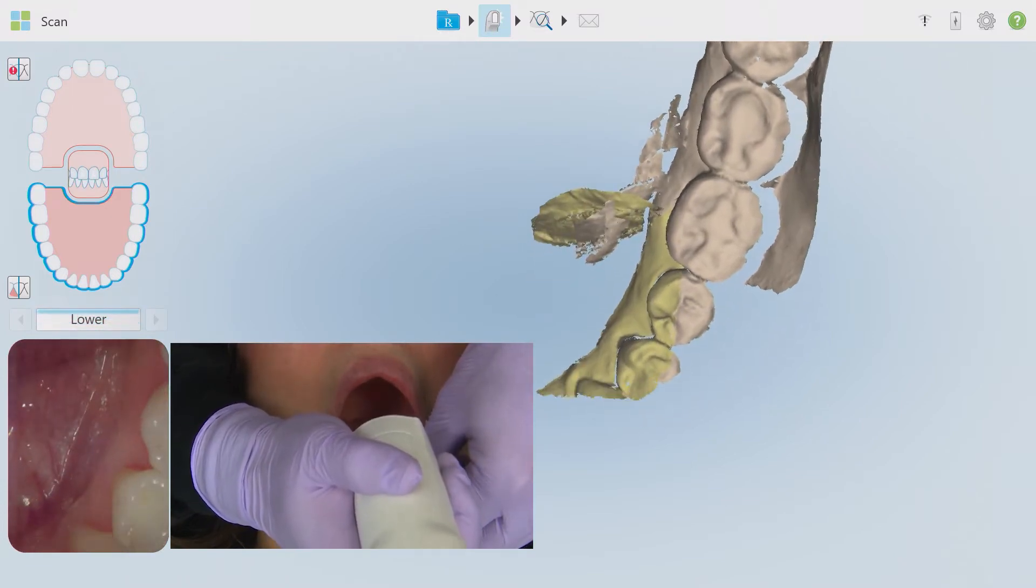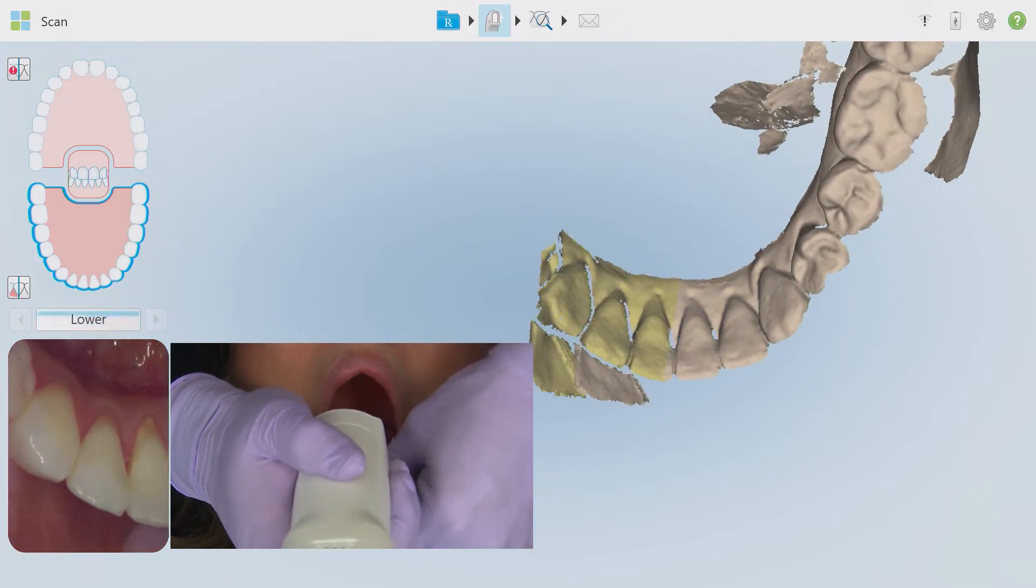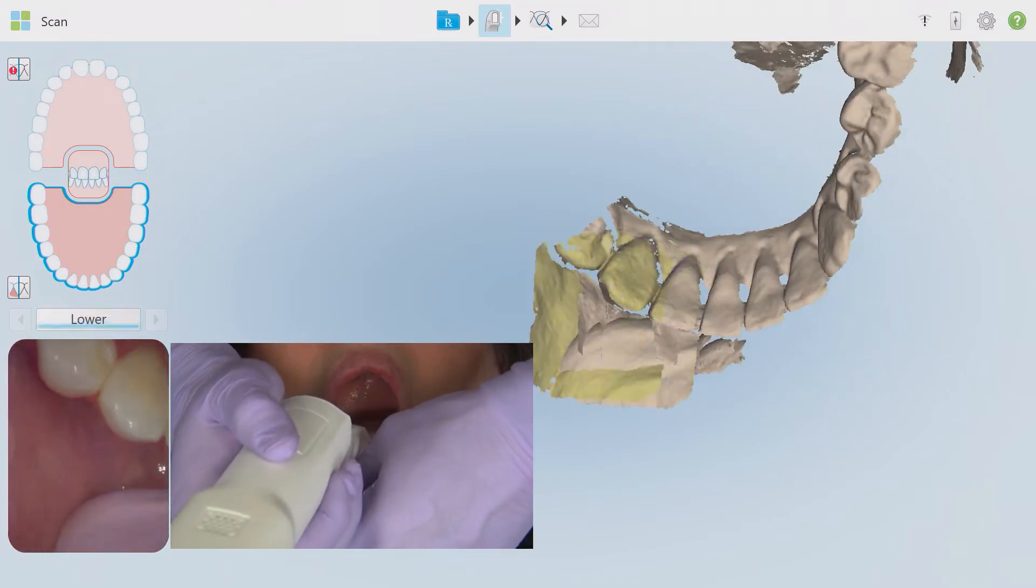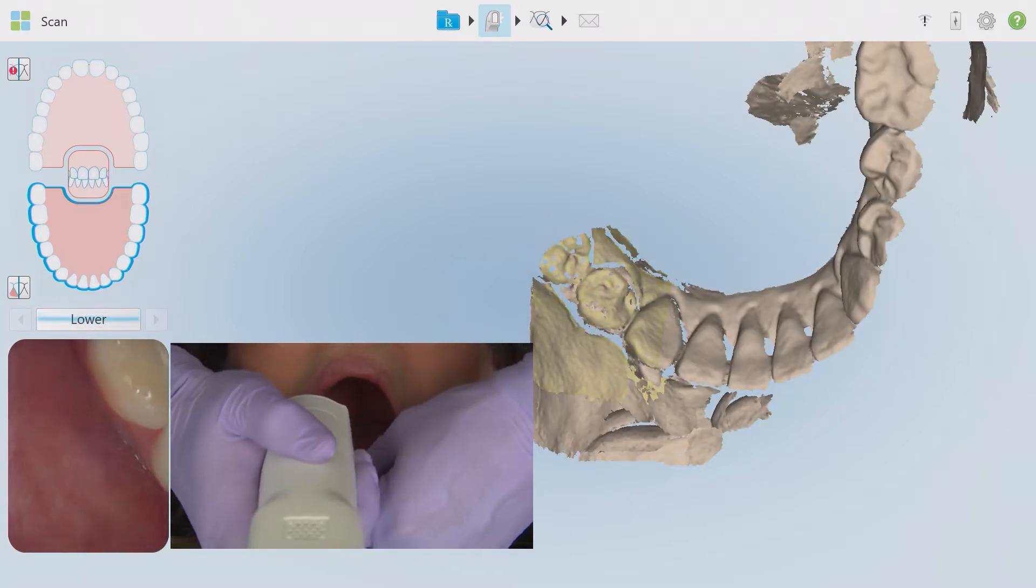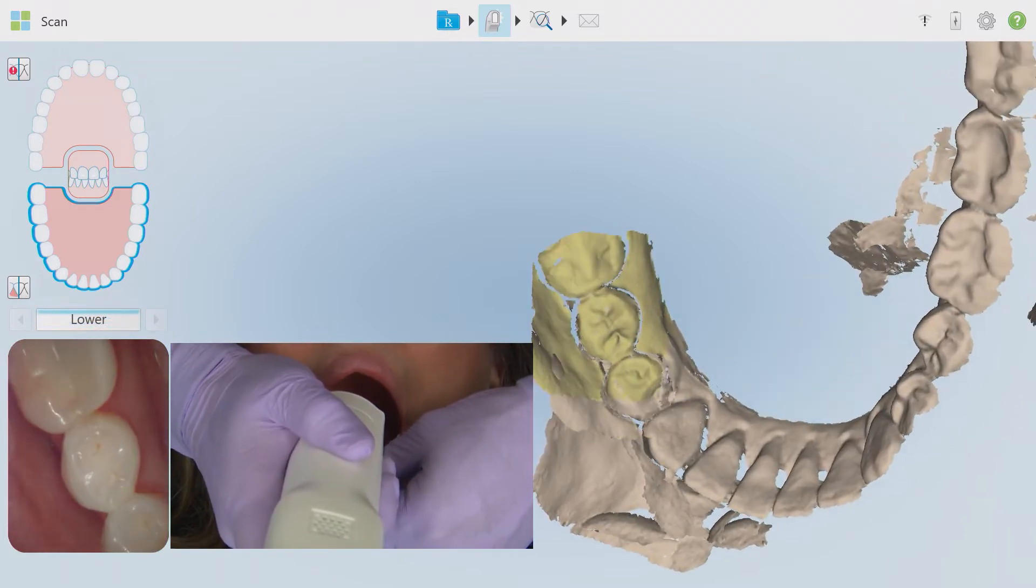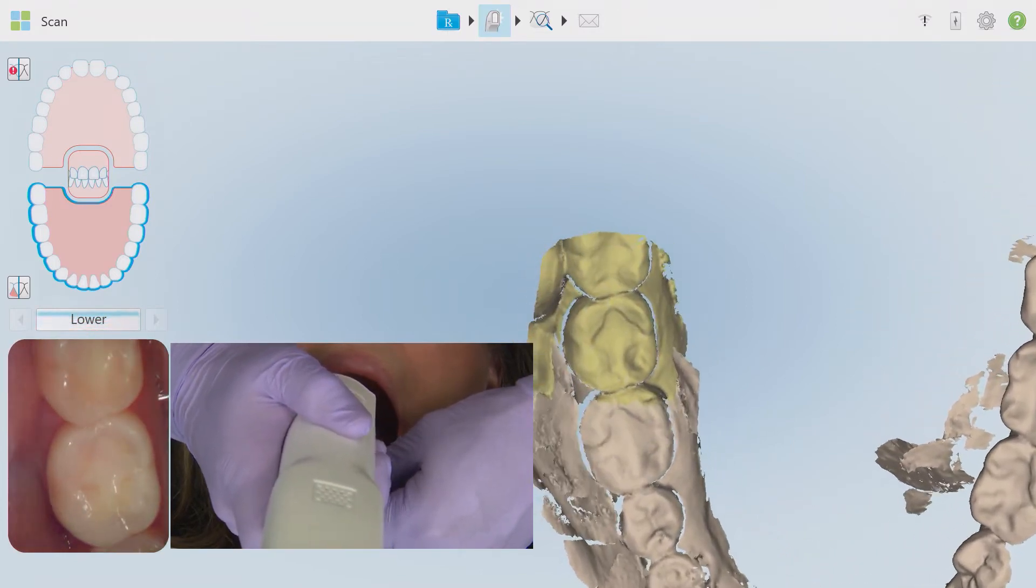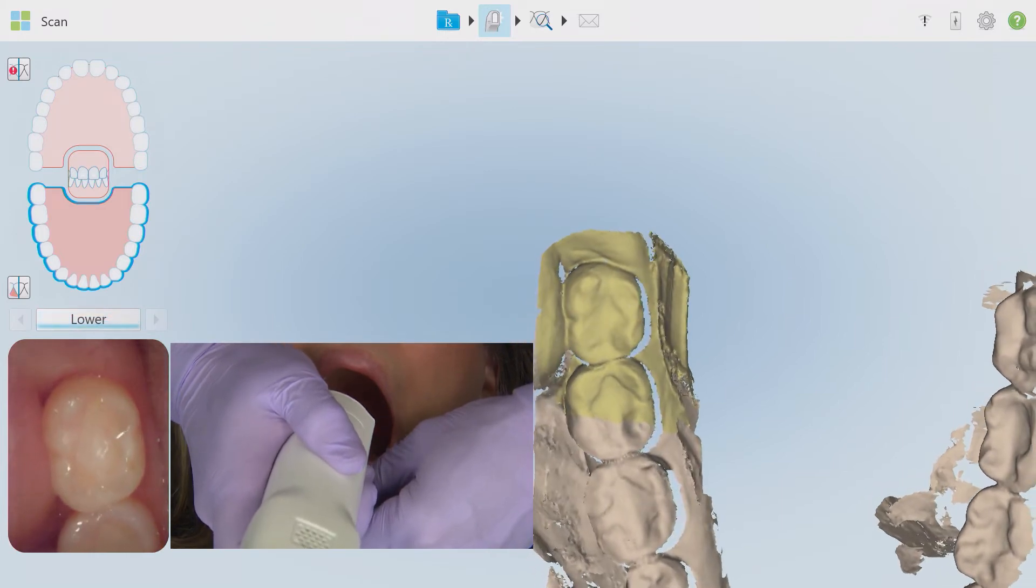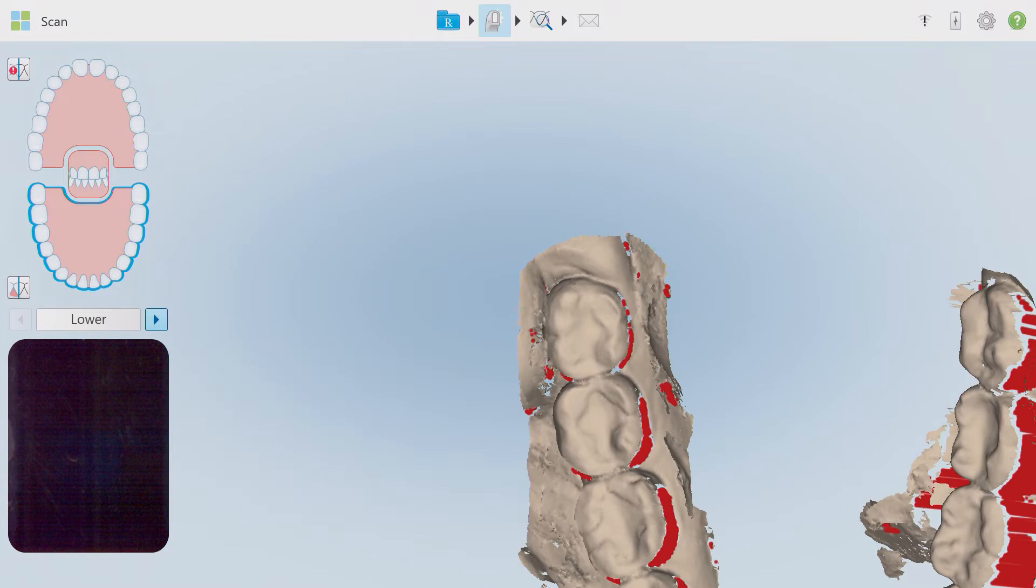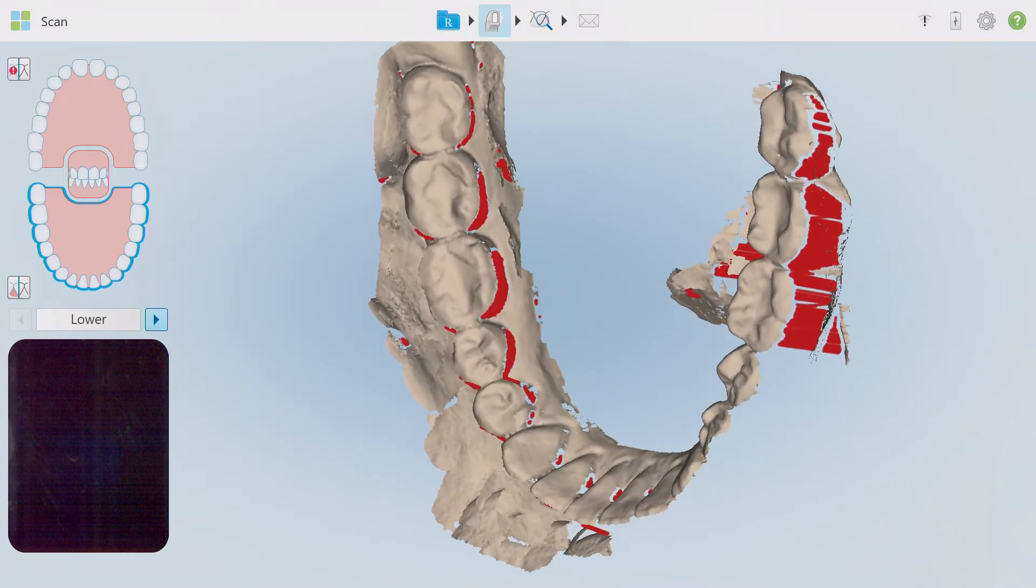As I'm wrapping around to the anterior of this arch, I need to stay more lingually inclined rather than looking straight down at the incisal edges. We're going to come back and recapture the incisal edge details later. A little side to side motion while moving along the occlusal surfaces of the molars helps the wand to easily move past the cheeks and the lips, especially if you're getting hung up there. Once you've made it all the way around the arch, go ahead and just stop the scan by again tapping one of the buttons found on the side of the wand. I just want to review what we've already scanned up to this point.